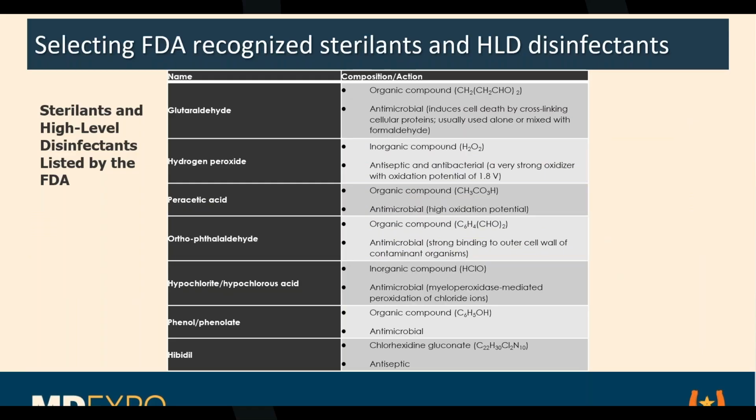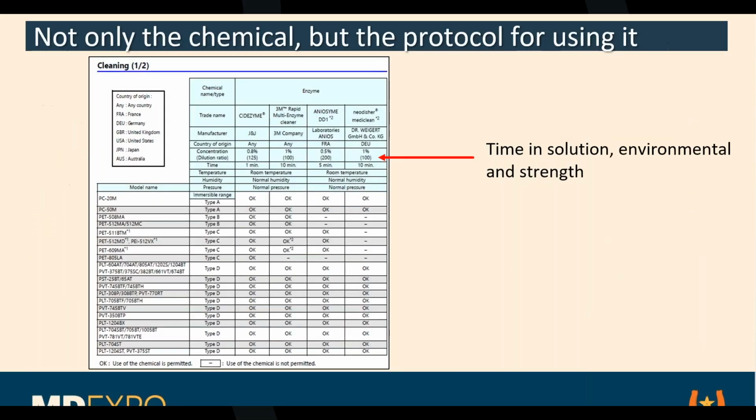Let it soak for 15 minutes at 4 inches of depth, you know, with the sun out. I don't know. There's a lot of different things that go into that, but you have to read that and make sure that not just using the right chemical, but they're following the right protocol as well. Does that make sense? Okay. So those are all there. And all these slides will be on the MD Expo website, and you can download anything that you want on here. So it's not only the chemical, but the protocol.